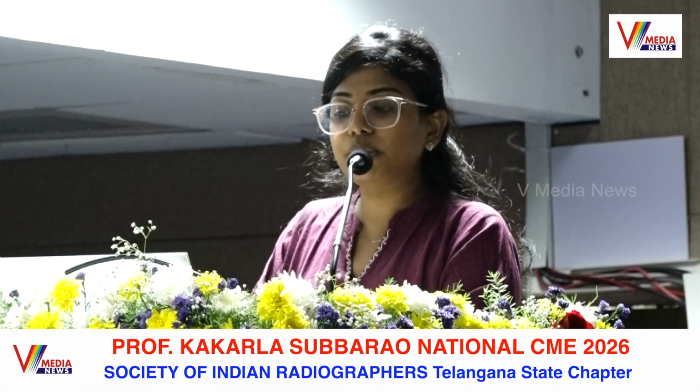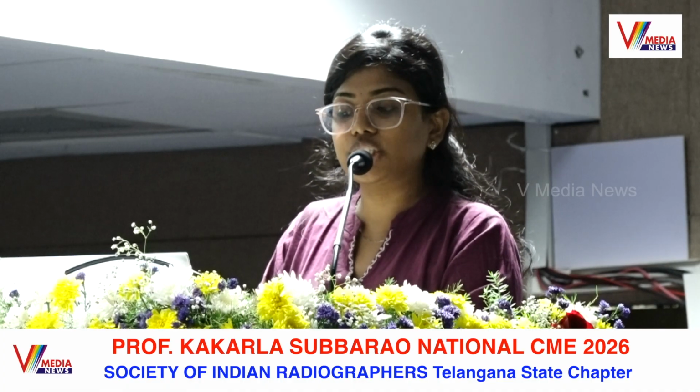According to the North American Society for Cardiovascular Imaging, there are a few standards. The equipment standards are CT systems with gantry rotation time equal to or less than 350 milliseconds, and the minimum detector requirement is a 64-slice scanner. There are dual head injection pumps that allow biphasic or triphasic injection. There are 3 phases: monophasic, biphasic or triphasic.